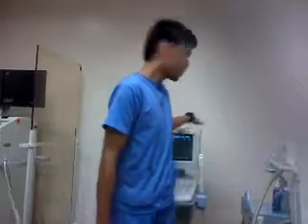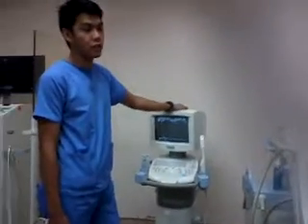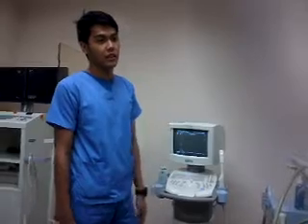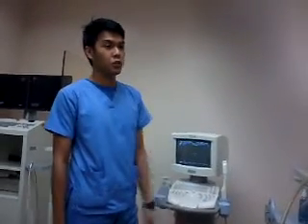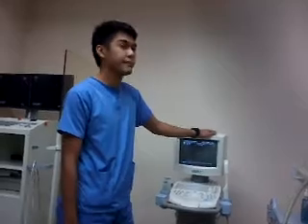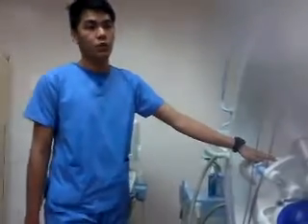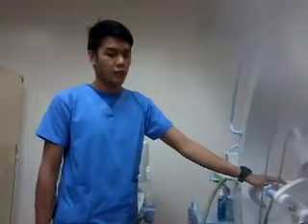To monitor the patients, we are in charge of viewing the inside of the patient while the nurses take care of them, providing necessities and assisting the doctors. But so far, this is the safest non-invasive procedure we can offer to eliminate a stone — unless you want to go to the OR and be cut. After the procedure, you go to OR recovery for one hour and then you can go home, unlike OR where you'd need to recover for a week or more.